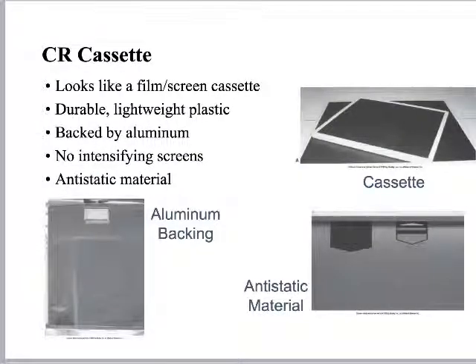So there's a bunch of different ways these cassettes can look. It looks, though, to me as an old school X-ray tech, a lot like the old film screen cassettes. It's a little less heavy than the old film screen cassettes, but it looks a lot like it. In fact, when I'm working with students in the lab, sometimes they grab an old film screen cassette rather than a CR cassette, and I have to tell them you can't use that. Like, it won't work, right?